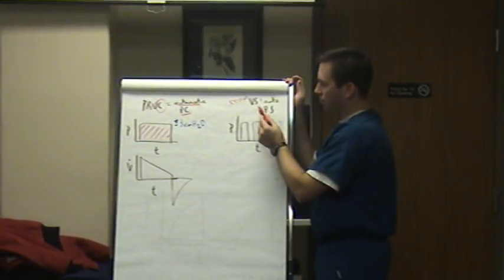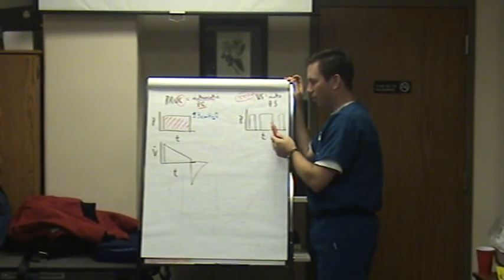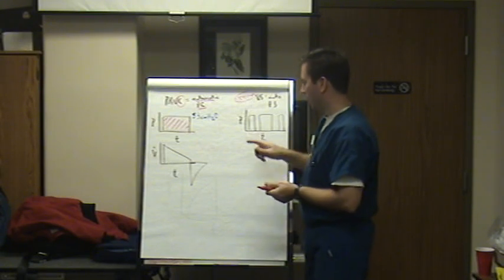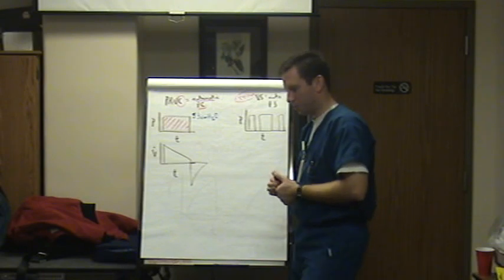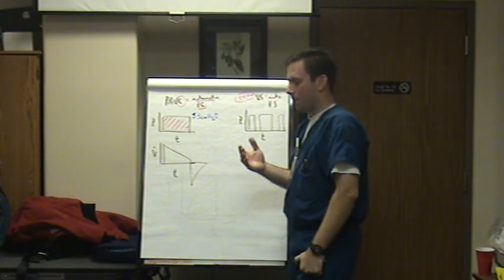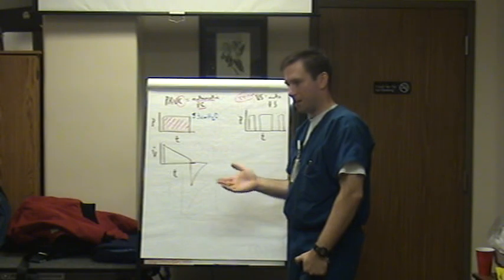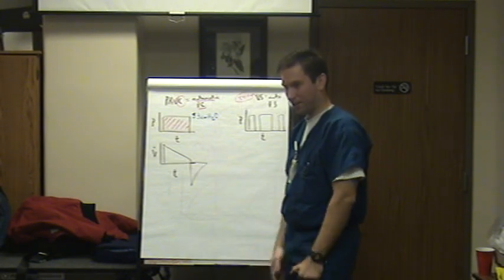But volume support is for the patient that we can set the tidal volume, and I no longer have to go in and out of the room and adjust the pressure support level. I'll tell you an example of this. A long time ago, if we had a patient in pressure support, Dr. Simpkins might say, Ryan, he really likes 350. When the patient's tidal volume gets less than 350, he wears out. He gets tired, gets tachypneic. So Dr. Simpkins says, Ryan, I want you to keep my pressure support at a level where my tidal volume stays above 350. And he used to write that order.